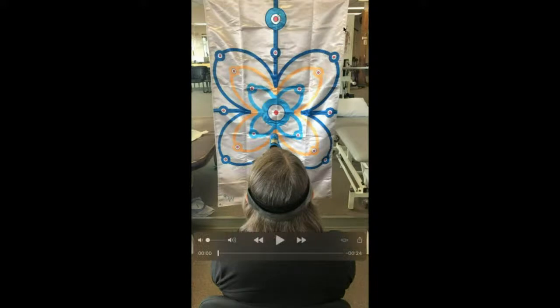I do have the laser so far up that she can't really see it. It's not under her field of vision as she's going back and forth. You'll notice titubations. So you'll notice an irregularity of smoothness of the excursion of the laser side to side. We need to figure out why that is. We also are going to notice a tendency to have increased left laser excursion here.